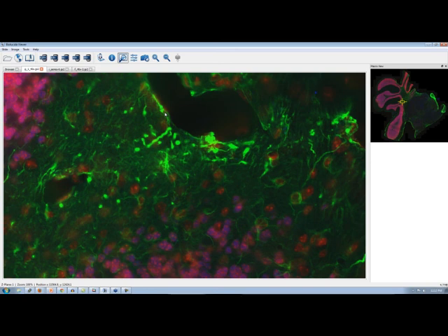So, Jeff, you've demonstrated zooming in the viewer, but before we get back to demoing how we navigate around images, I want to make a quick point that relates to zooming at different magnifications that really became apparent to me when using this. And one of the great benefits of using captured images as compared to performing an analysis directly on a tissue sample is the ability to quickly change the magnification by zooming.